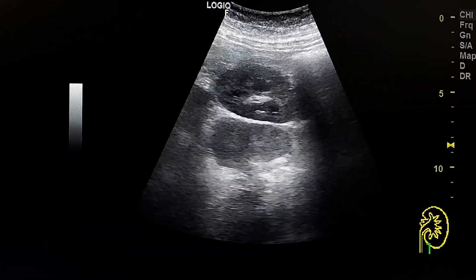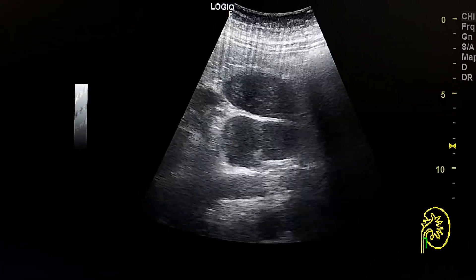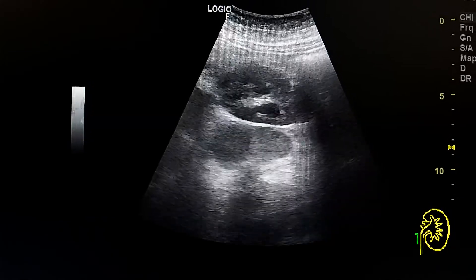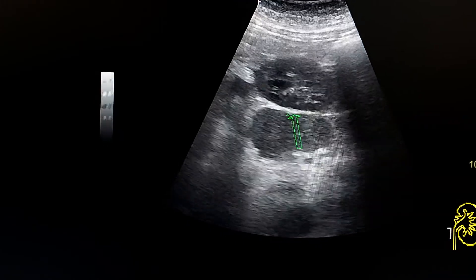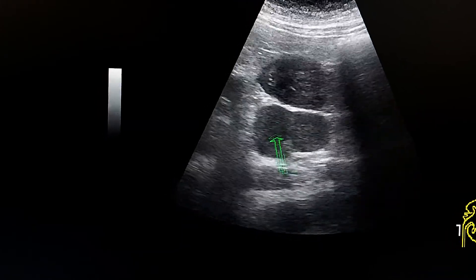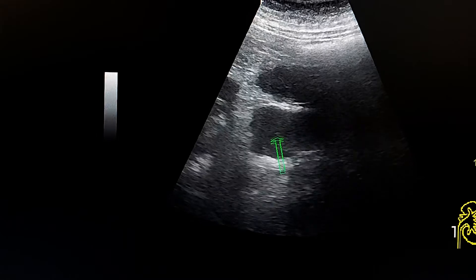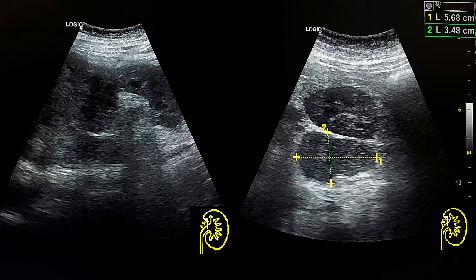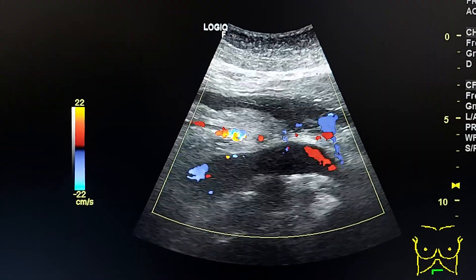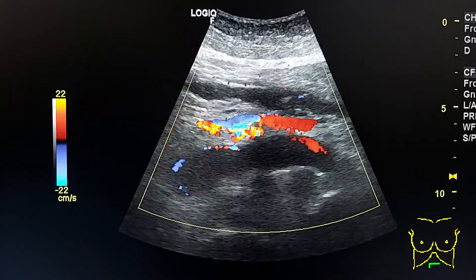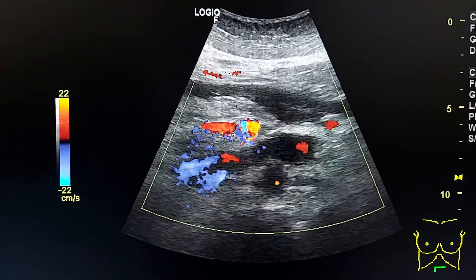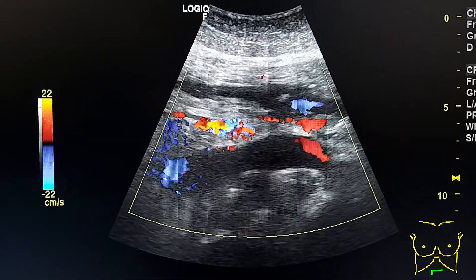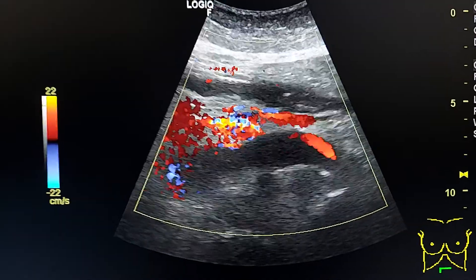Here, medial to the lower pole of the kidney, we see an enlarged lymph node. This is the lower pole, and this is the enlarged lymph node, which is hypoechoic. In this transversal view at the midline, we see a distended left renal vein.